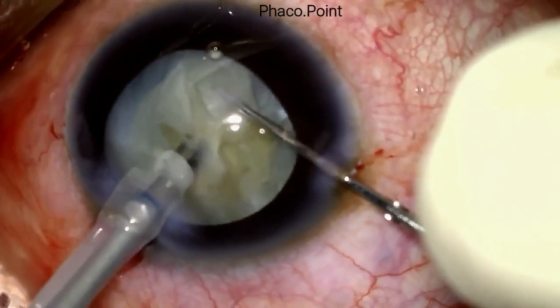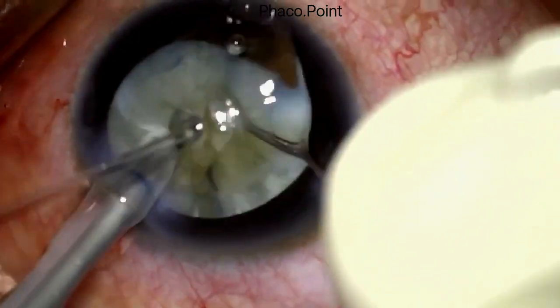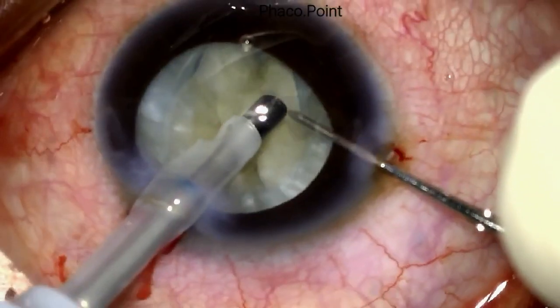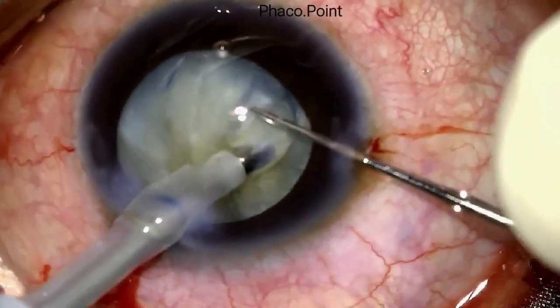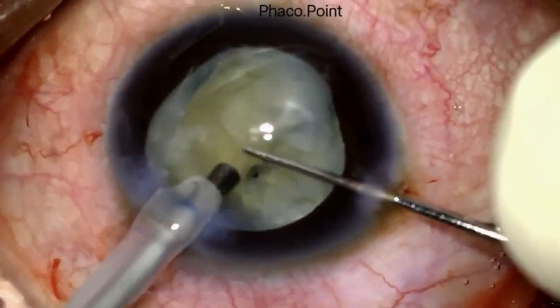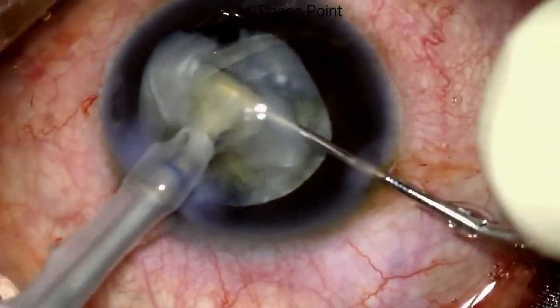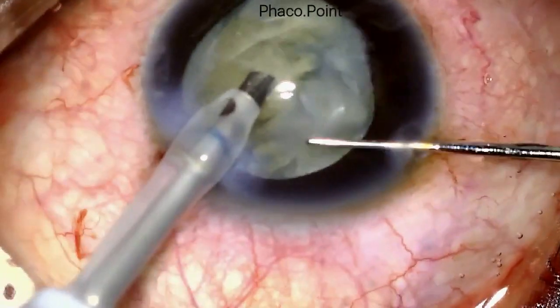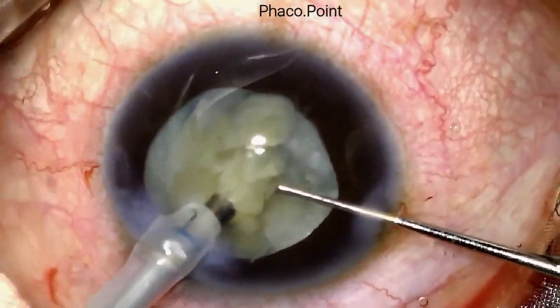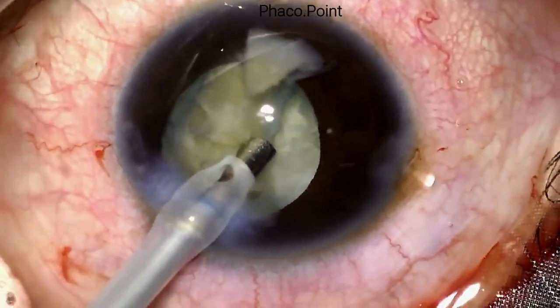This is an intumescent soft cataract — it is not a very hard cataract. Had it been a hard cataract, I would most certainly have converted to a manual SICS, because intraocular manipulations dealing with a hard cataract with a torn anterior capsule carry a much increased likelihood of propagation of the tear extending posteriorly and compromising the posterior capsule.